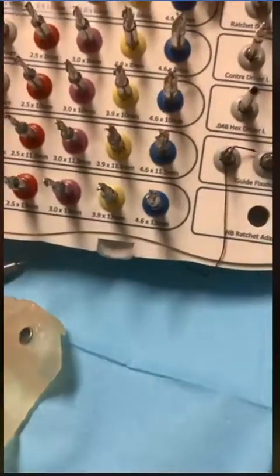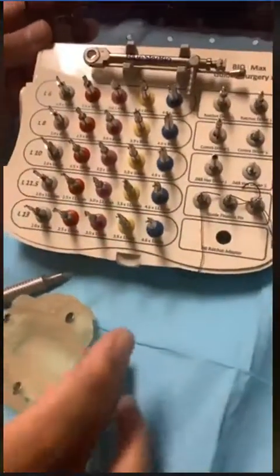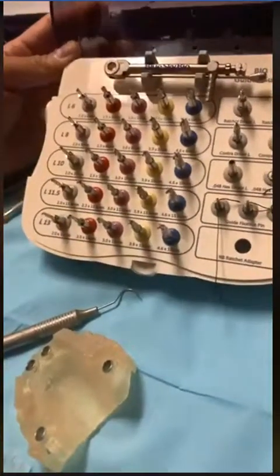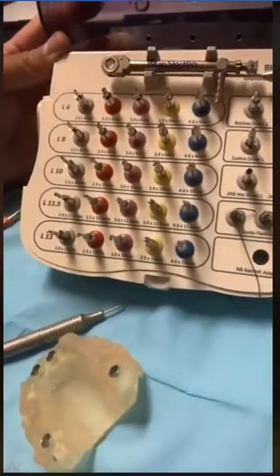No, okay, we should have put the light on. Okay, so let's just continue. I apologize. I would have wanted to put a little bit more light so you can have a better look at this.